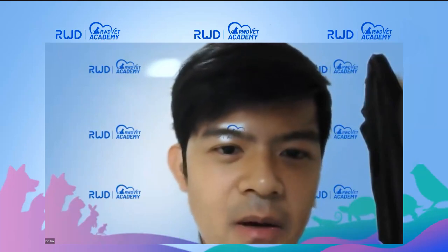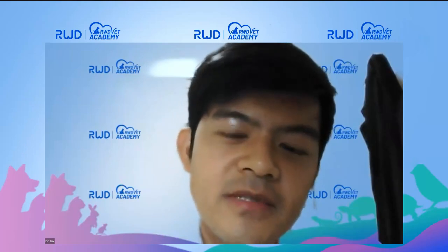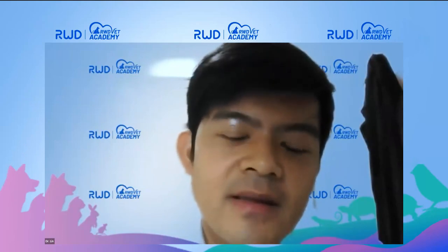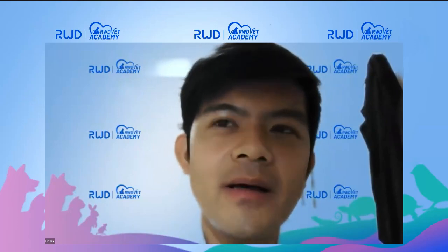The next is, what parameters do you use for laser acupuncture per acupoint? For example, frequency, time, power. Oh, it's a good question. I usually use laser acupuncture at 4 joules per square centimeter, and each point about 4 seconds. So it's very quick to complete the session. And I will do laser acupuncture about 2 or 3 times per week.